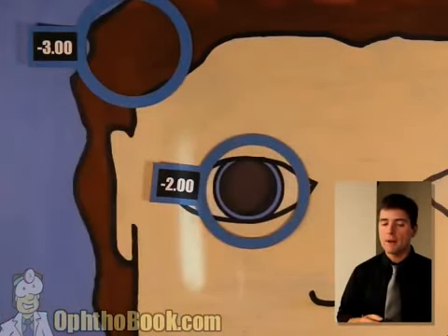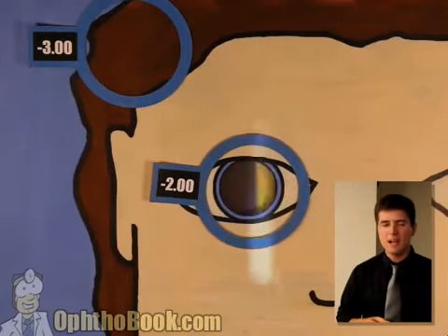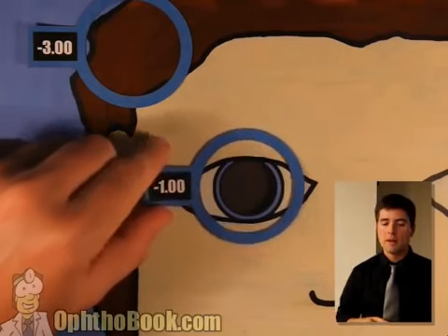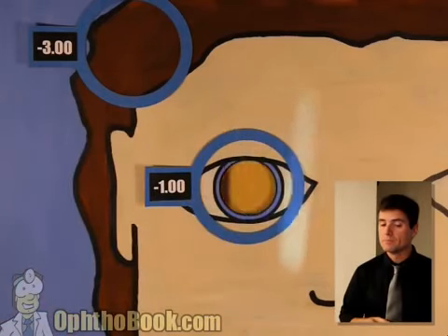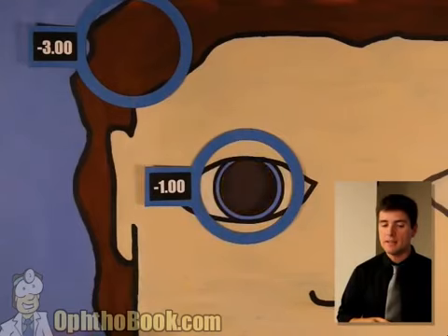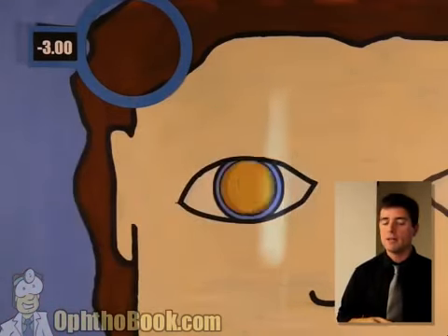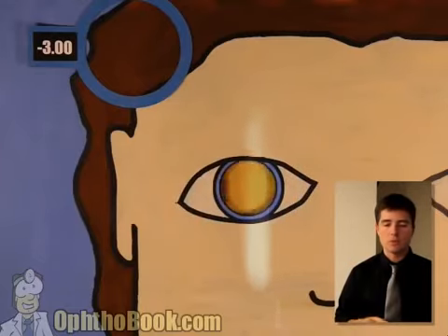So we're going to add a little power. No, still need a lot more, it looks like. That's surprising. Okay, let's add some more power. -1, let's try that. I think we may have it. This might be it. Do I try for more? Do I dare? Let's try plano. No, plano's too strong. The -1 was the right one.